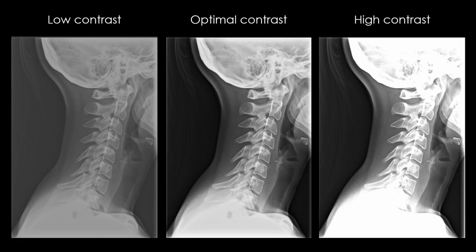So we have three different examples looking at this low contrast view. We can see primarily between fat and muscle, if we're looking at the posterior aspect of our cervical study, the posterior subcutaneous fat and nuchal ligament, you can see that the border between, again, fat and water are very indistinct.